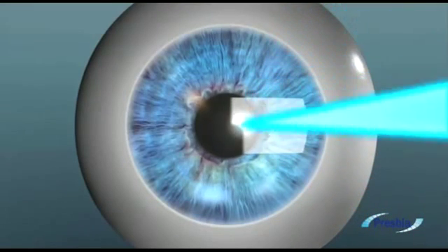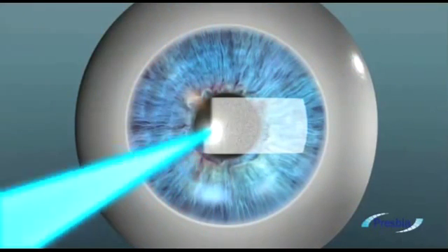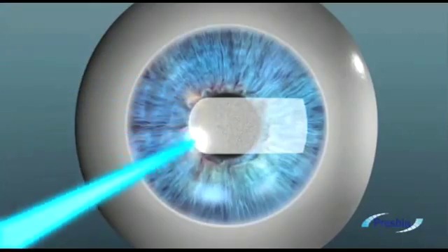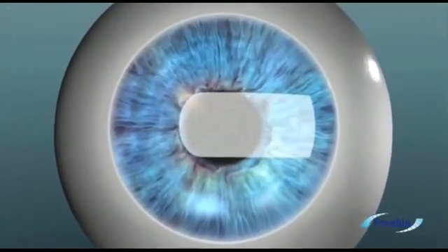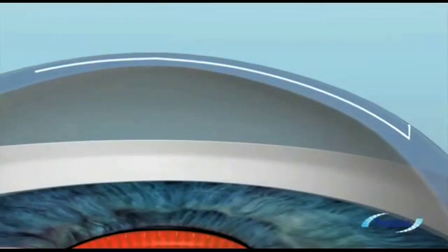The doctor creates a small pocket within the corneal stroma of the non-dominant eye using a femtosecond laser. This middle area of the cornea houses the microlens just above the pupil, and the implanted lens is not visible to the naked eye.